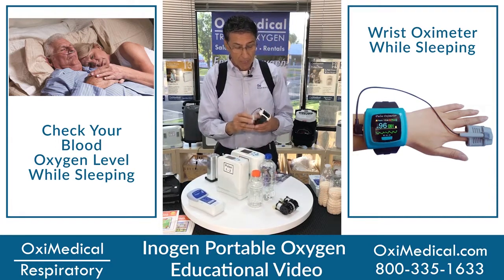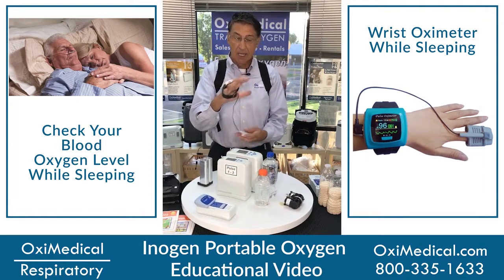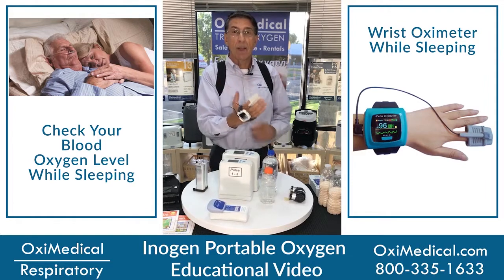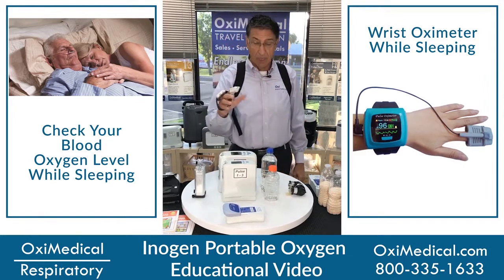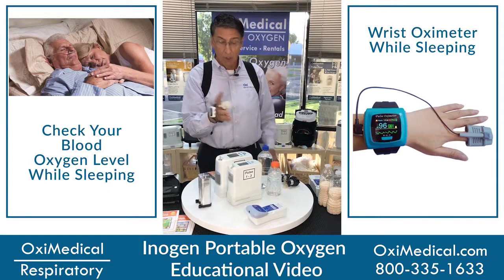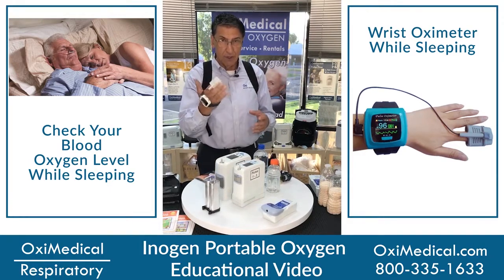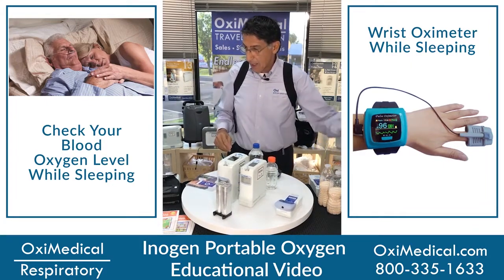I also recommend that you use a wrist oximeter. You can set this for 90%. Always check with your doctor to make sure if you can use the Inogen at night. A wrist oximeter will wake you up if you go below the 90% threshold. Very handy device, less than $150.